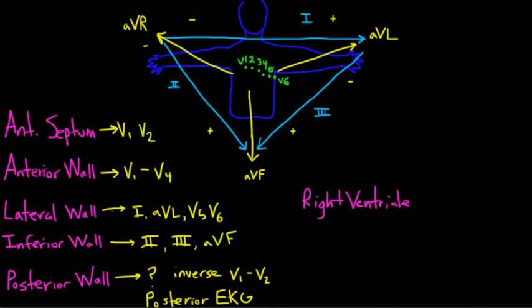It's pretty important, it gets a lot of blood supply and blood flow, and problems ensue when it infarcts. But the right ventricle can be involved as well. There are a few things you can do to evaluate the right ventricle. You can order a right-sided EKG with the leads basically flipped to the other side and interpret that correctly.